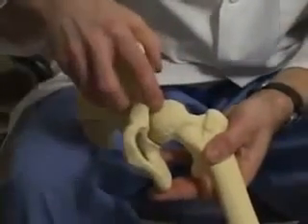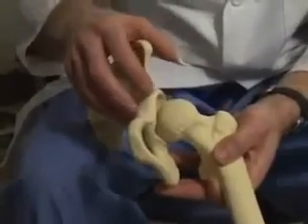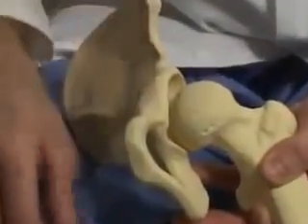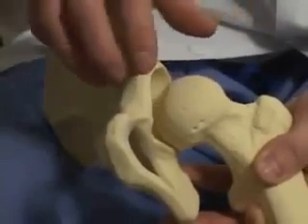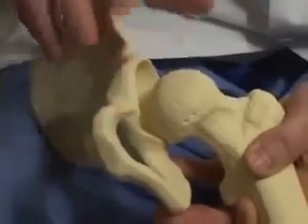The other type of condition where hip arthroscopy is gaining a greater role is to treat something called femoral acetabular impingement. Now let me explain the anatomy here a little bit. And if I can show you on this model of the hip joint, there are actually two different important compartments in the hip. The central compartment is the space between the ball and the socket, as I've alluded to. And in that space, that's where you can have the conditions that I've mentioned, like a labral tear or a tear of the articular cartilage that lines the ball or the socket, a tear of a ligament that goes between the ball and the socket, a synovial or capsular condition. That's the central compartment. That's the space that we initially examine when we do a hip arthroscopy procedure.